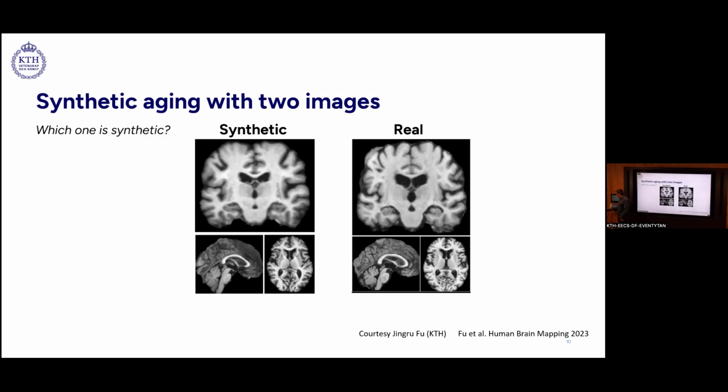Yeah, so it's kind of okay. Of course we are not medical doctors, so we asked a radiologist to check a lot of images, and his task was to just say synthetic or not synthetic, and he got it right only in 63% of the cases. So I think it was a very good result.